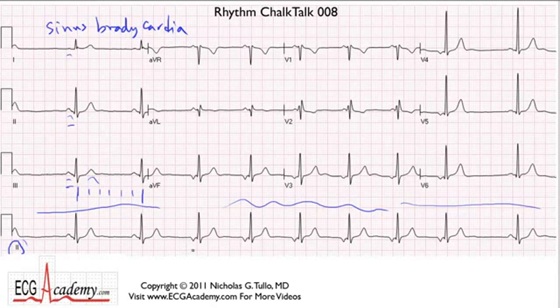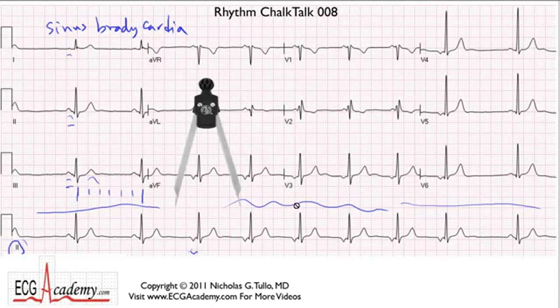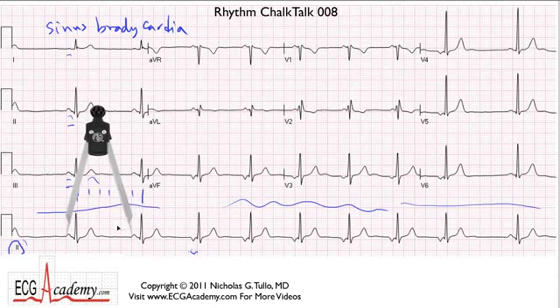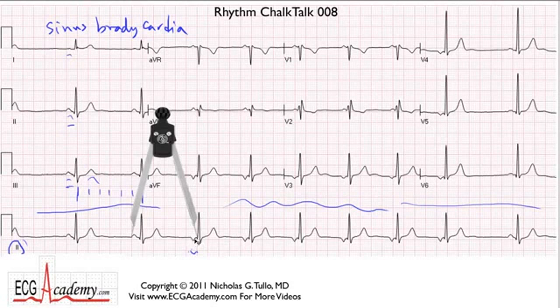The P wave looks different — it looks upside down, it's an inverted P wave in lead 2. That makes you think the P wave is coming from somewhere else in the heart. After all, axis gives you an idea of direction, and if the P wave changes its axis, that usually means the P wave is coming from a different spot in the atrium. Bringing up calipers set for 50 beats per minute, we can see this P wave not only changed its axis but also came a little bit early — so this is an ectopic beat coming from some focus in the atrium.